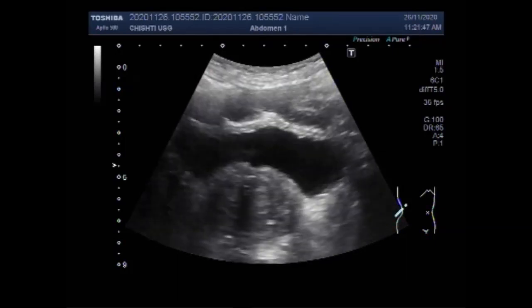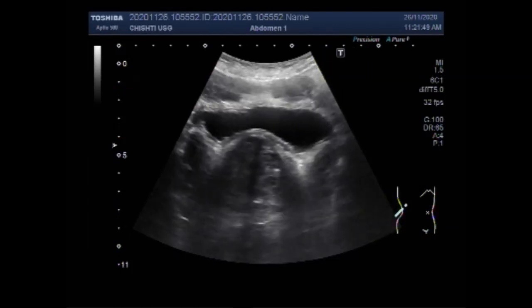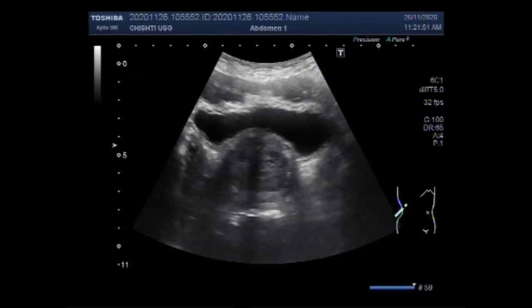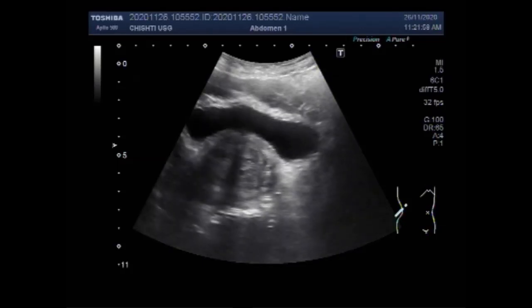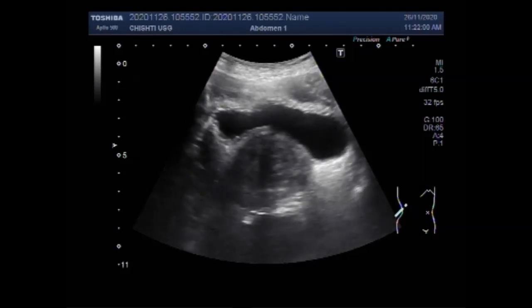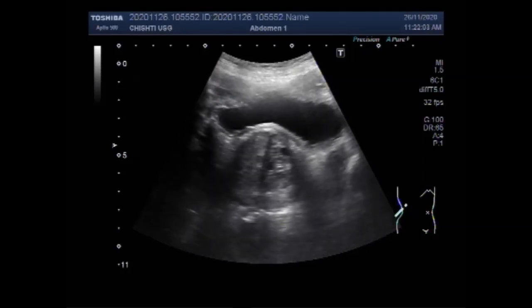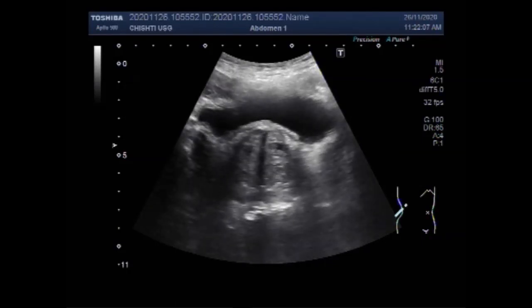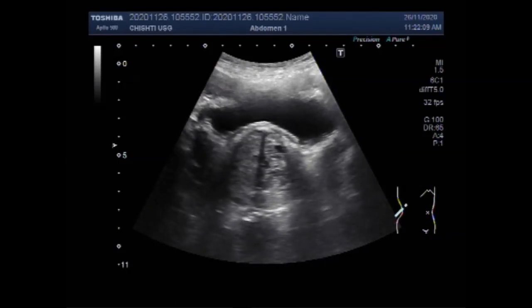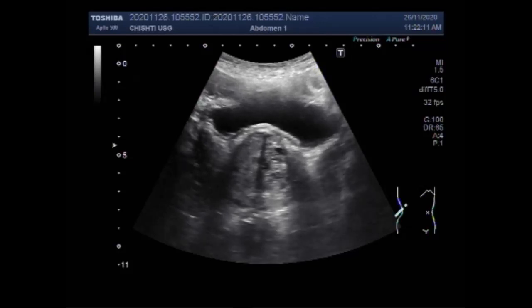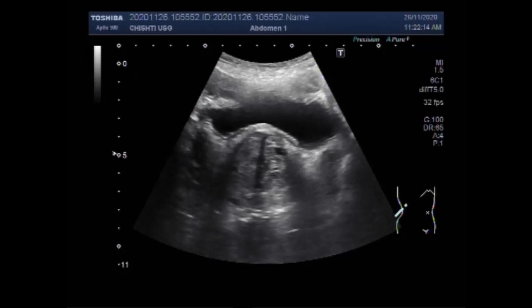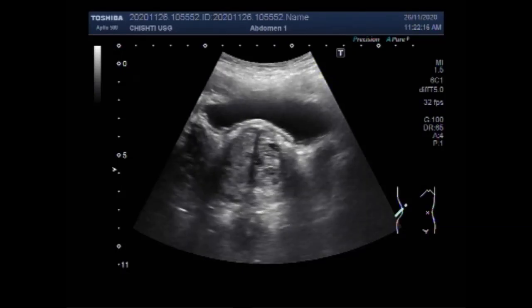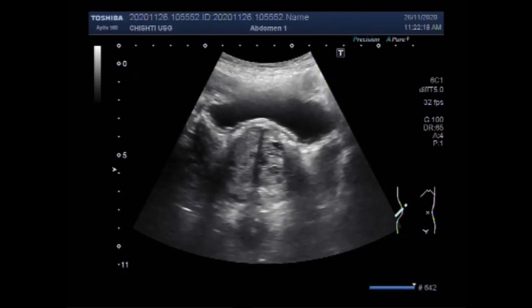Now you can see the urinary bladder and the enlarged prostate. Benign prostatic hyperplasia, also called prostatic gland enlargement, is a common condition that men develop as they get older.